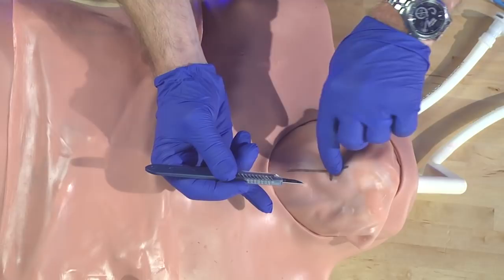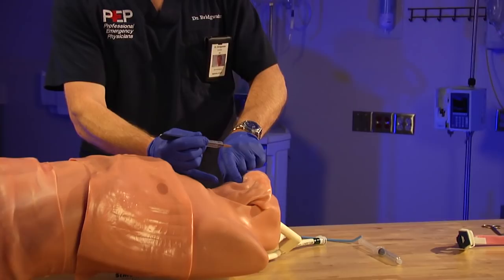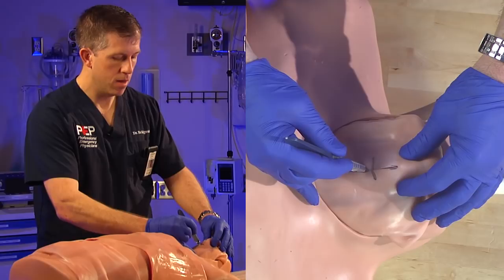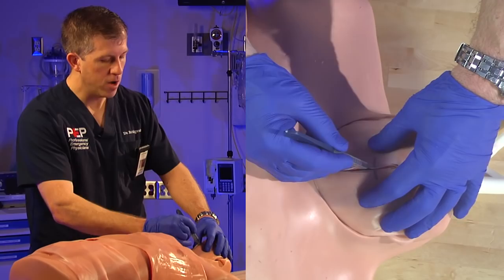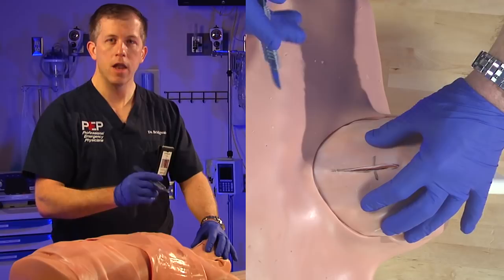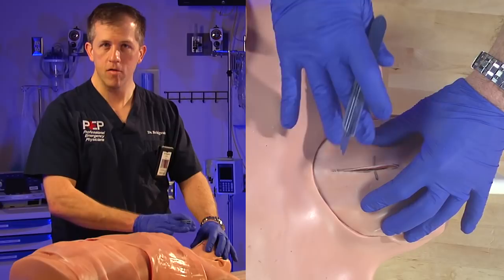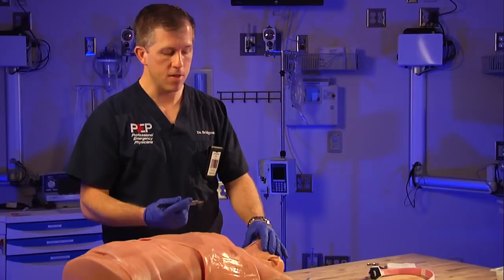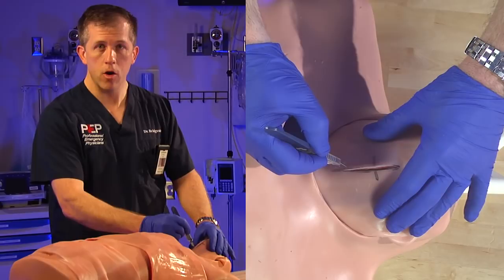Grab the thyroid cartilage to stabilize things, confirm your membrane is where you think it is, then make an incision starting at the thyroid cartilage, coming down over the membrane and straight down over the cricoid ring. How far? Make sure you get it over the entire membrane and large enough to get your fingers and equipment in — you don't want to make it too small and have to extend it later. A good landmark: start over the thyroid cartilage and extend all the way to just over the cricoid ring. That should completely expose the cricothyroid membrane.